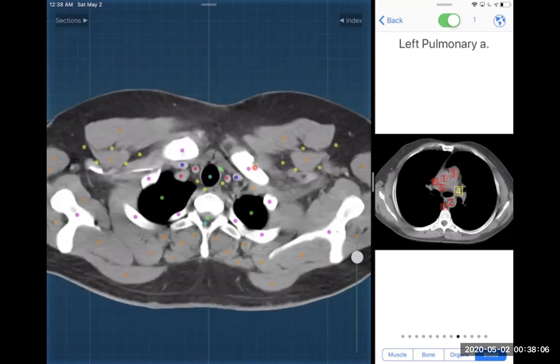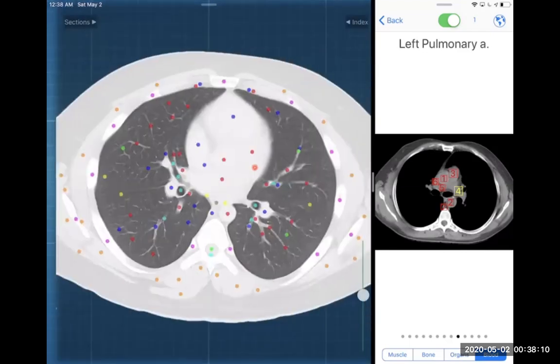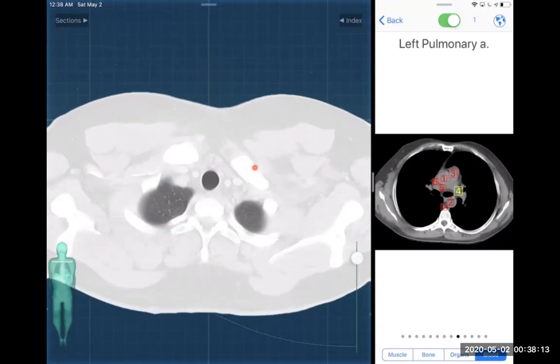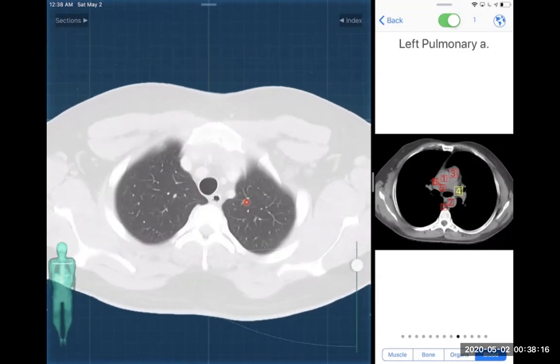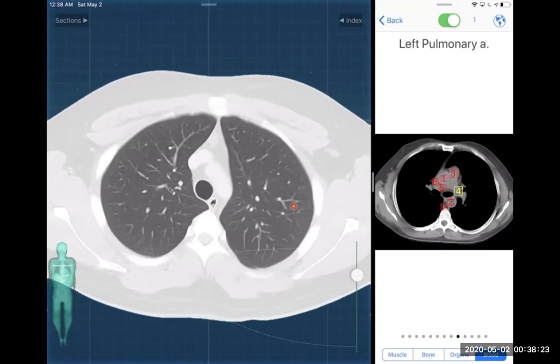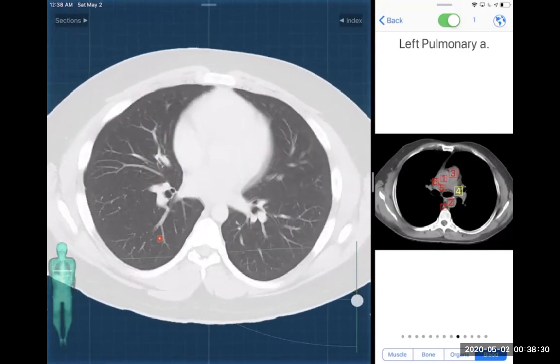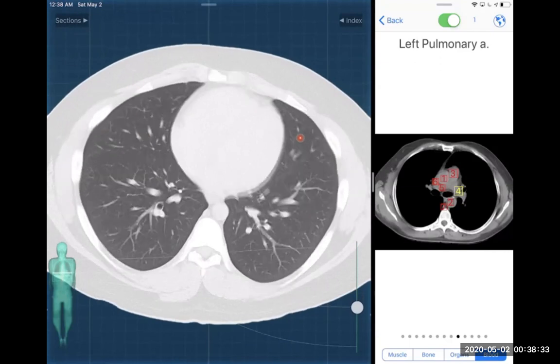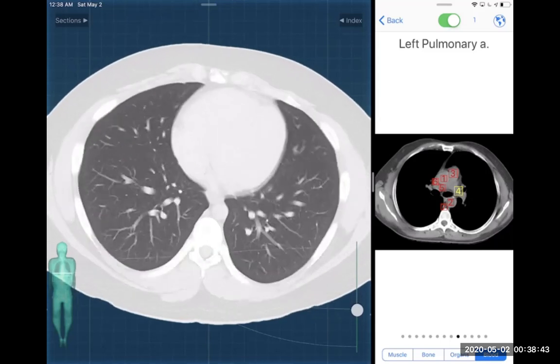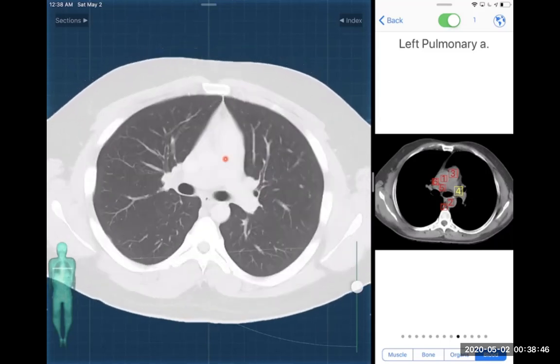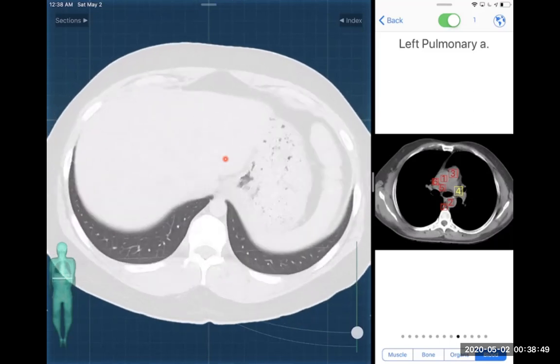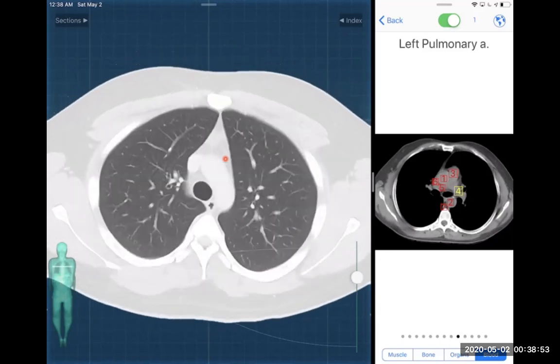We must not forget to assess the CT scan in the lung window as well. This is for assessment of the parenchyma and any airway — for example, searching for pneumothorax: this is air inside the bronchus, and you may see air inside the pleural cavity. The lung window is essential for pneumothorax and interstitial lung diseases. For example, this is the middle lobe, this is the lingula, and these are the right and left lower lobes.